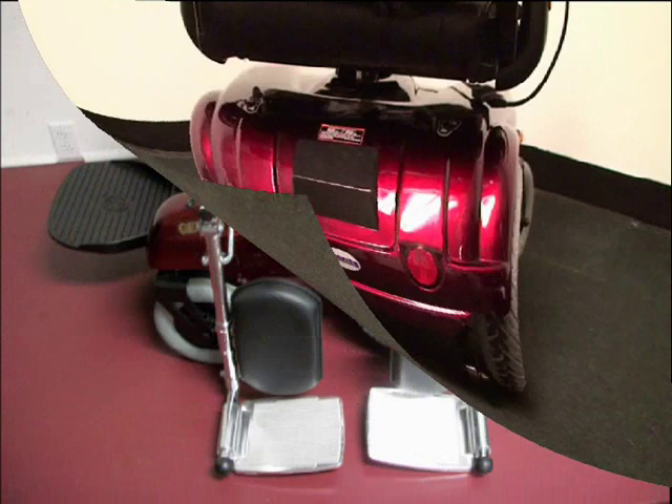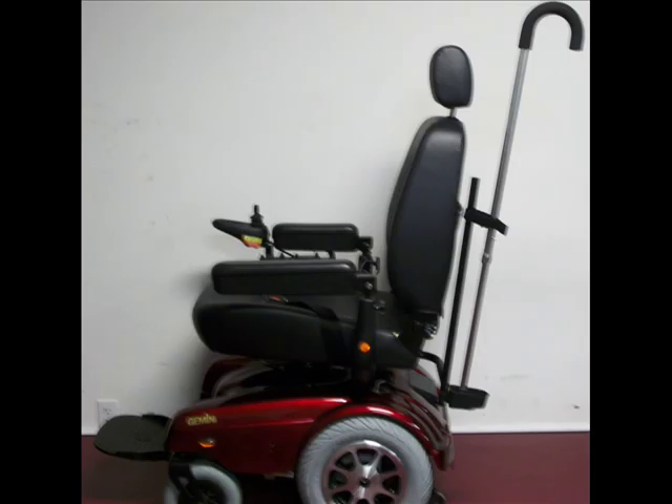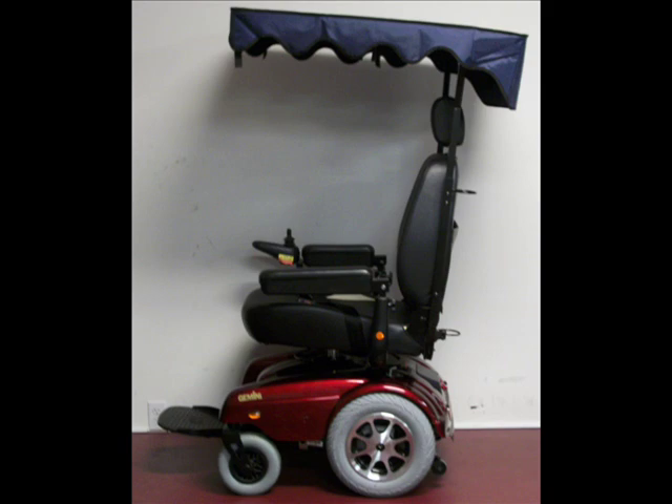Along with elevating leg rests, oxygen tank holders, cane, crutch and walker holders, foldable rear baskets, and canopies are also available accessories for the P301.